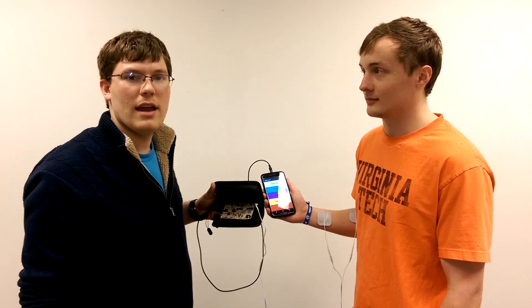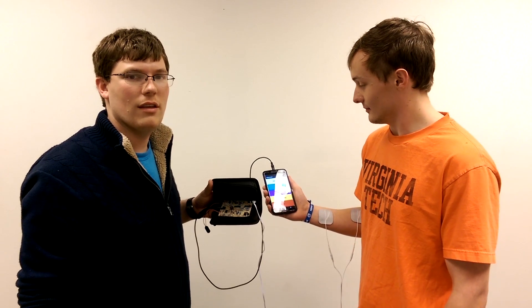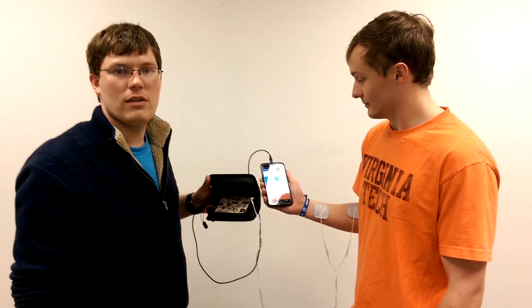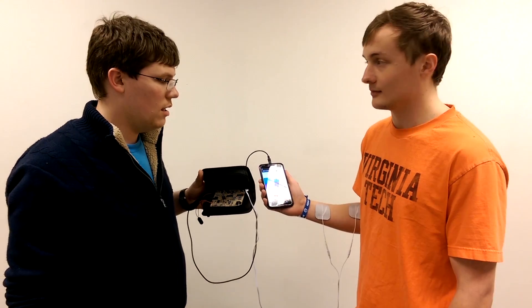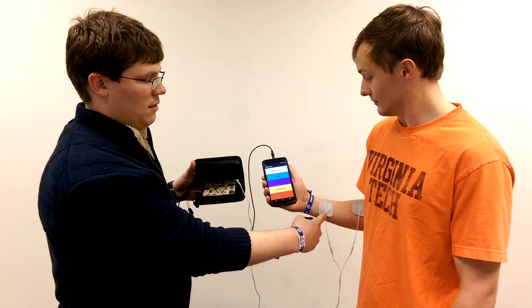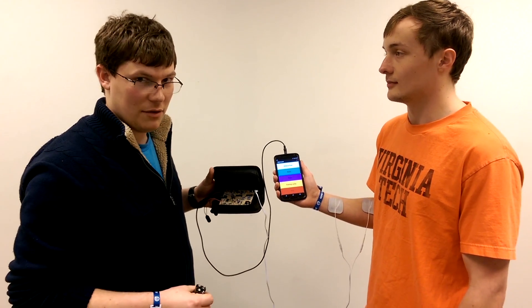What we decided to make was an Android-controlled TENS machine. A TENS machine is a device that's used to relax or block pain in your muscles, and it is emitted through these electrodes that we have on Connor's arm.